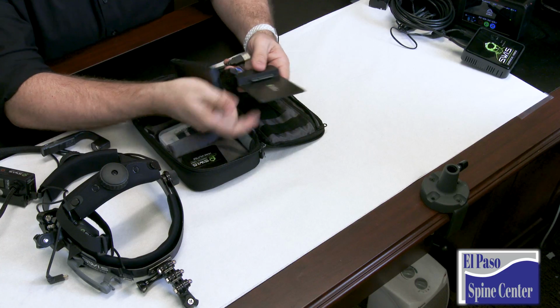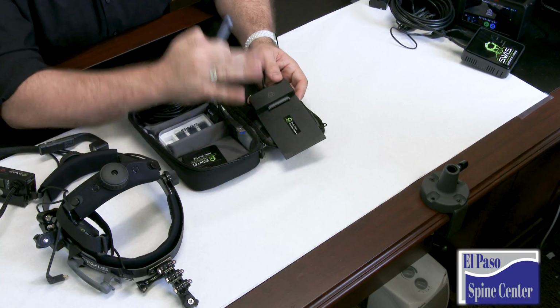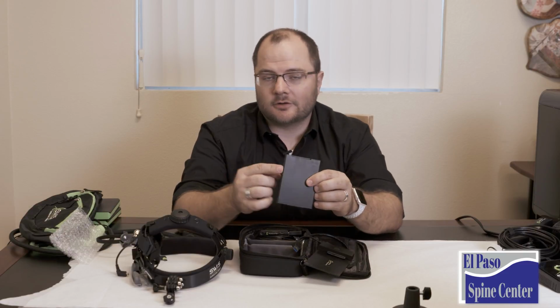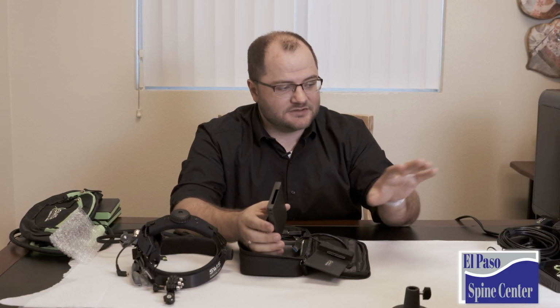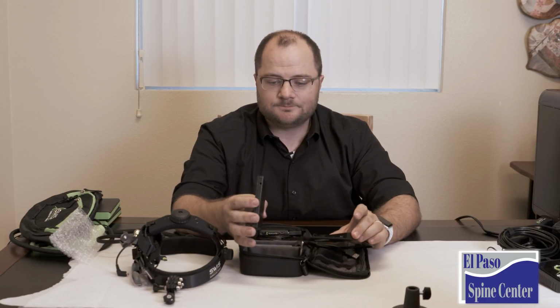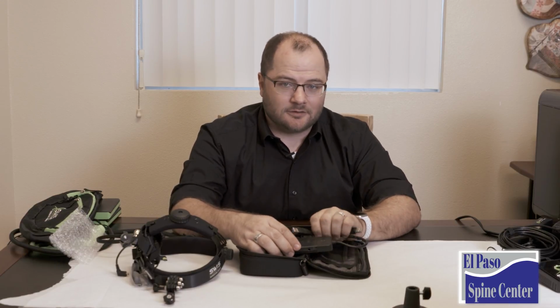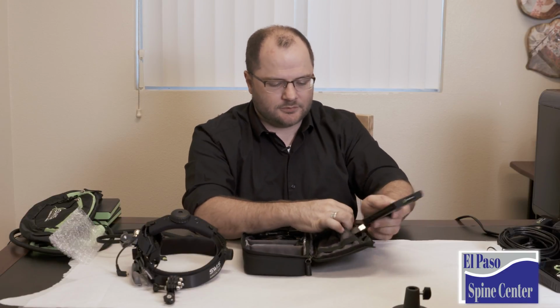Inside of this upper pouch is the docking station for the hard drive from the Atomos. This is a blank drive. You can actually put another hard drive into this. That's a little beyond the scope of this video, but you can put another hard drive into this to have multiple recording hard drives with your HDMI, with your Atomos. But with the one that's in there, all you do is pull it out, plug it in here, plug that into your computer, and you can read it just like any other hard drive on your computer. But that's where the reader for that is stored. So I'm going to put this back in here.